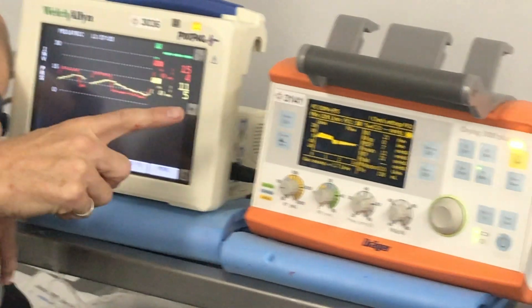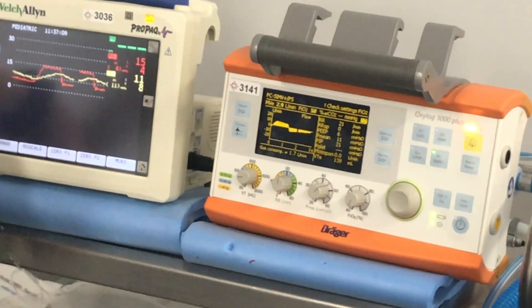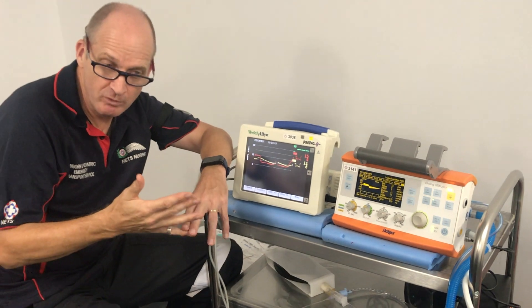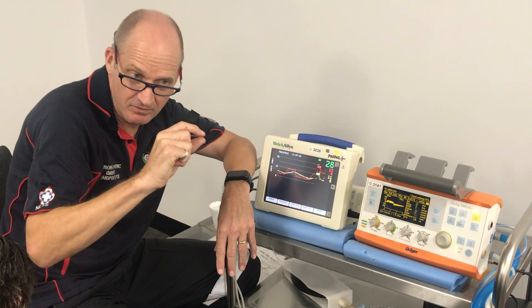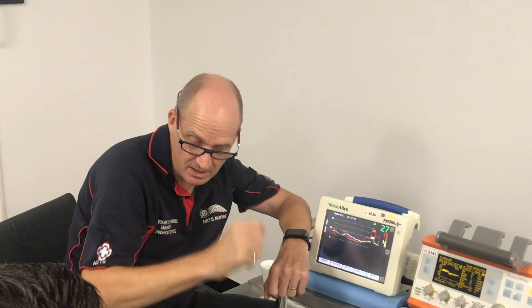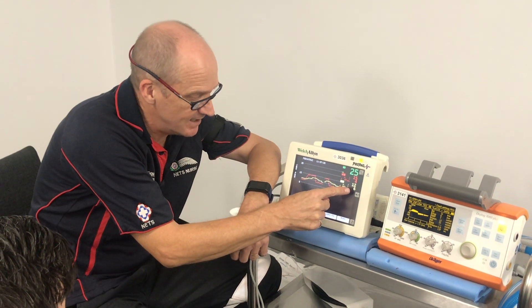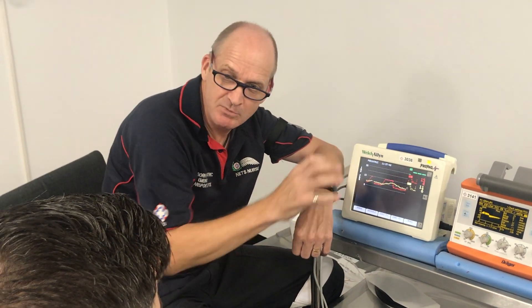The number one biggest thing we can do with the Oxylog on a small tube is slow the rate down — that will make the biggest change, with a slight additional improvement from increasing I-time. It's the opposite of normal ventilation strategies; it's specific to this ventilator because it just doesn't seem able to get the flow through a small tube. You're treating it almost like an asthmatic — longer, slower breaths rather than faster, bigger breaths. You can now see we're getting 12 on 6 where we previously had essentially a flat line.